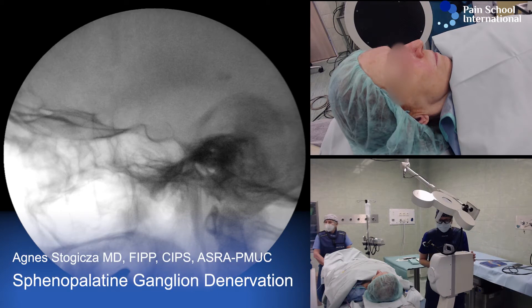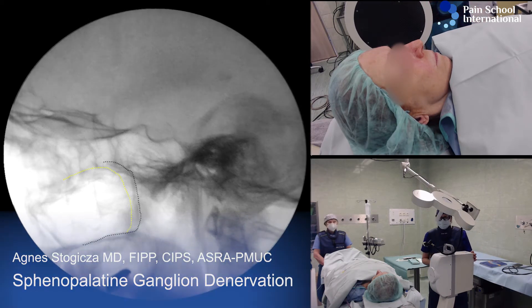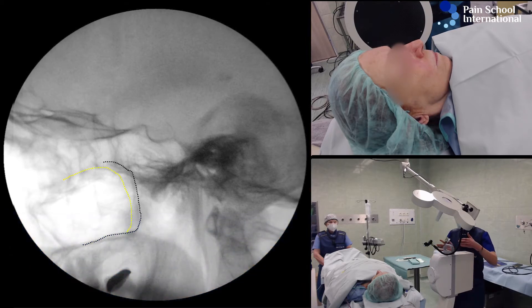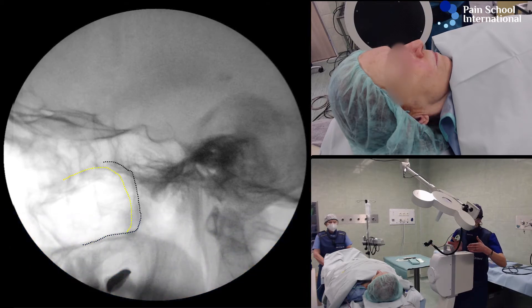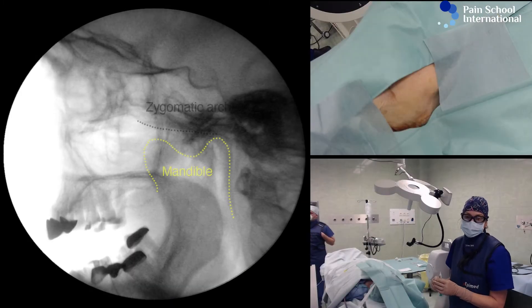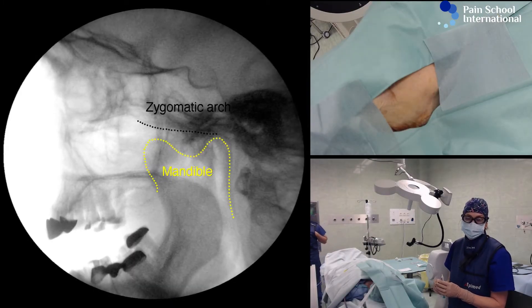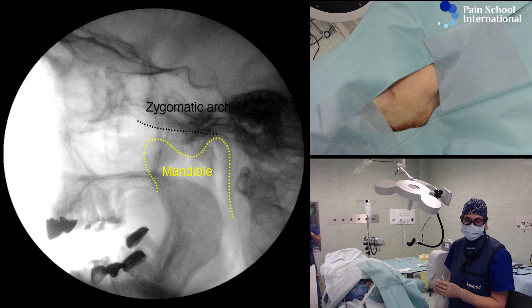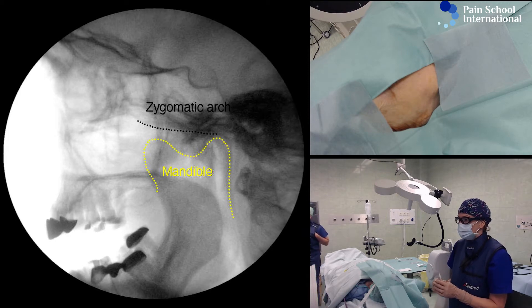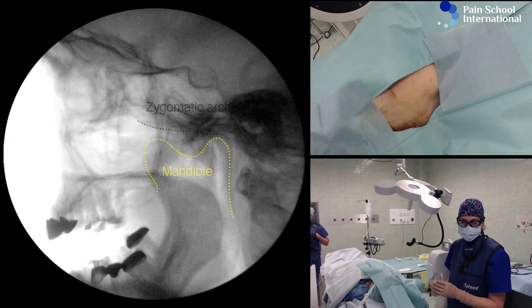The two maxillary sinuses are not overlapping completely. We can think of two movements — either moving the C-arm or moving the patient's head. You can see I have highlighted on the x-ray the zygoma, which essentially covers the entire pterygopalatine fossa in this case.